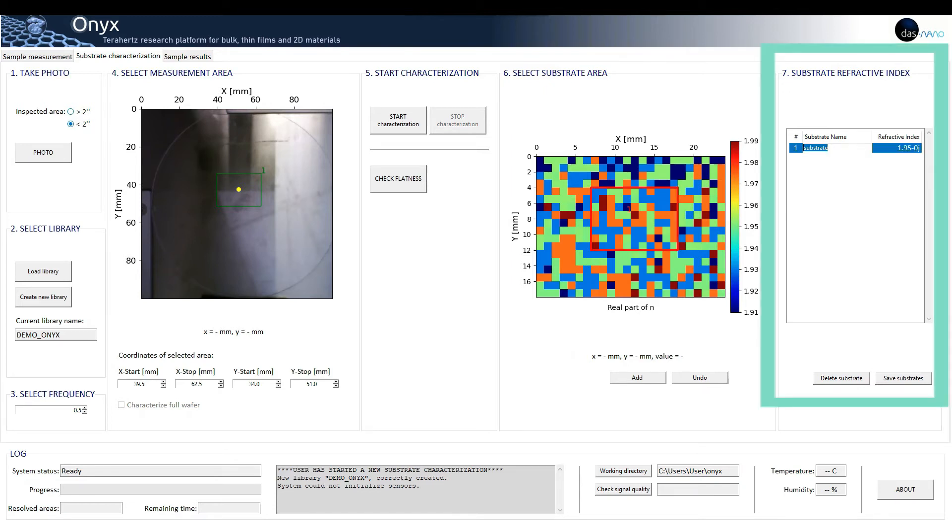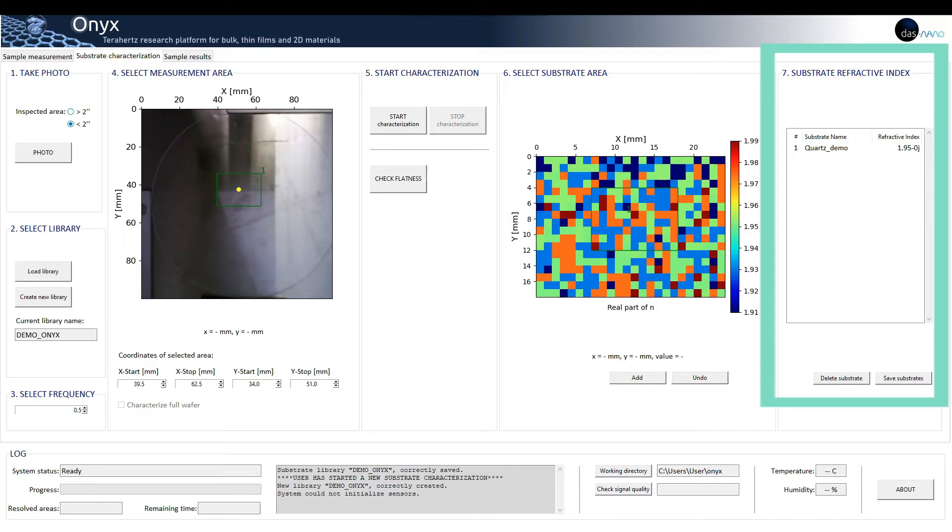Seven: substrate refractive index. The user can easily rename the substrate for later use and save it in the desired library.